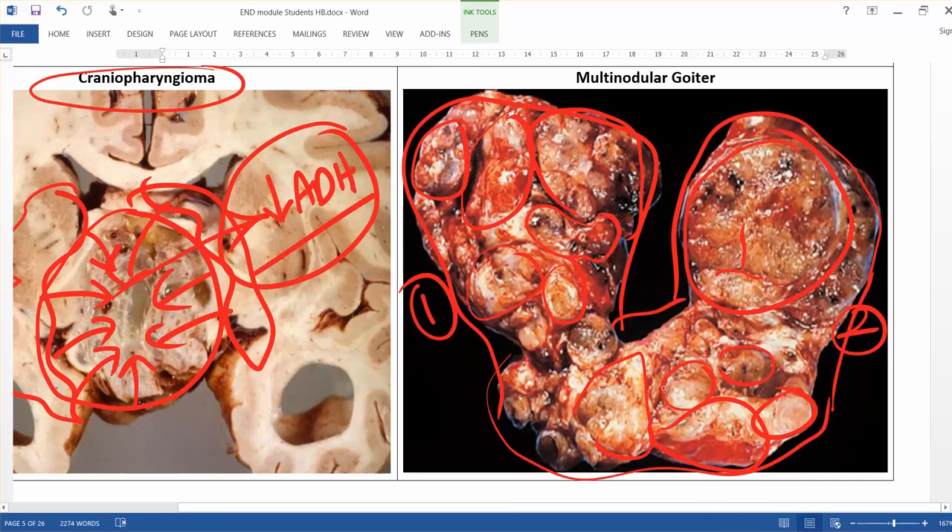This is called multi-nodular goiter. We cannot come to a definite diagnosis unless we take a section and examine it under the microscope to determine whether it is hyperplastic multi-nodular goiter or shows inflammation. You can also relate it with hormone profiles — for example, if this goiter is producing a reduction in T3 and T4, the patient is in a hypothyroid state.